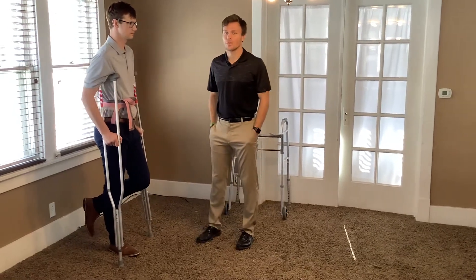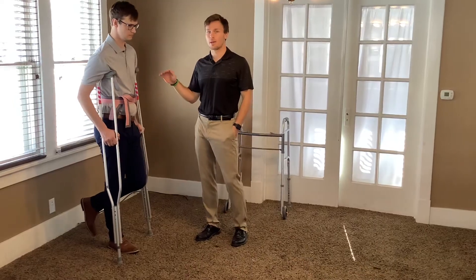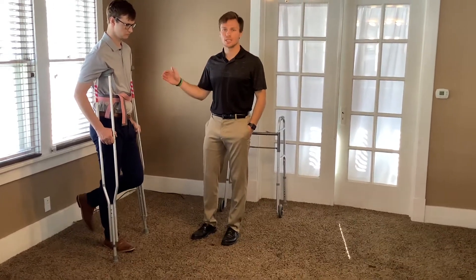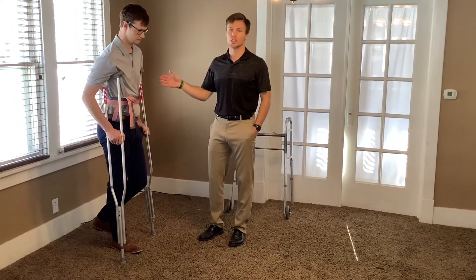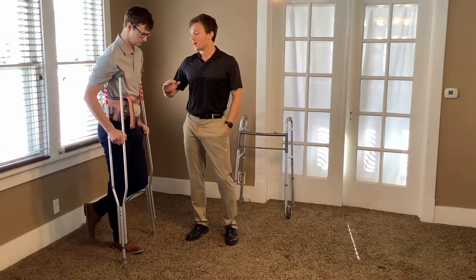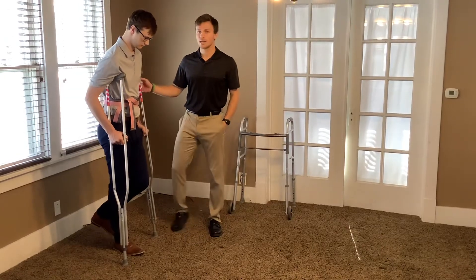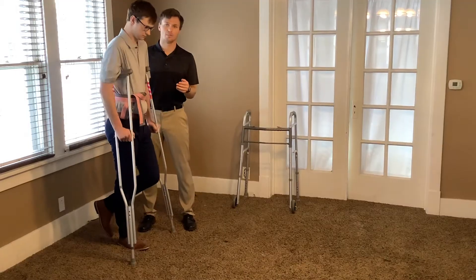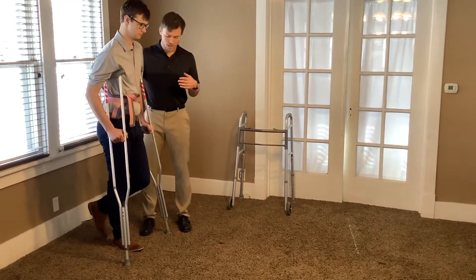We're going to go through a three-point gait pattern. Normally you would teach your patient the gait pattern when they're sitting down and demonstrate first, but for the sake of time we are going to go through it with Ryan. As you can tell, we are going to have a gait belt on him, and I'm going to be standing on his affected side in case he falls — this allows me to pull him back closer to my center of gravity.